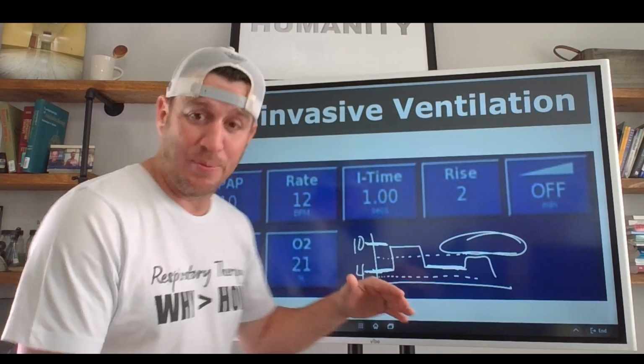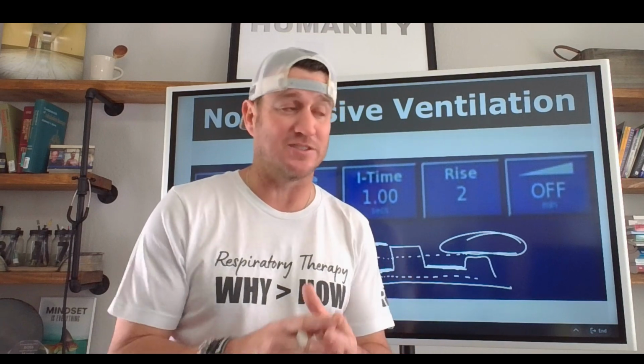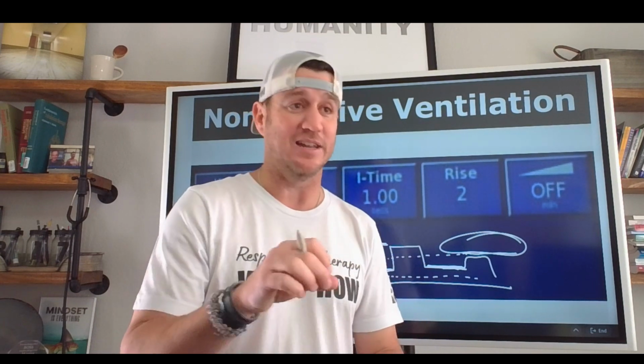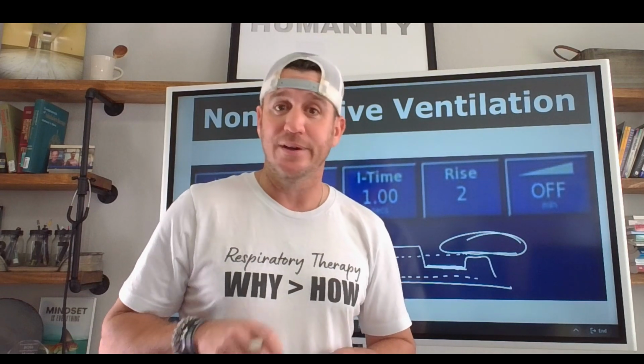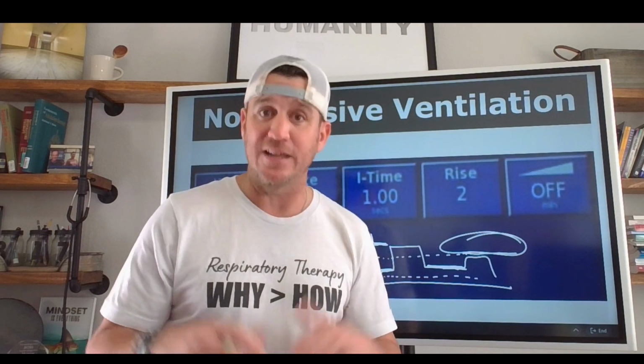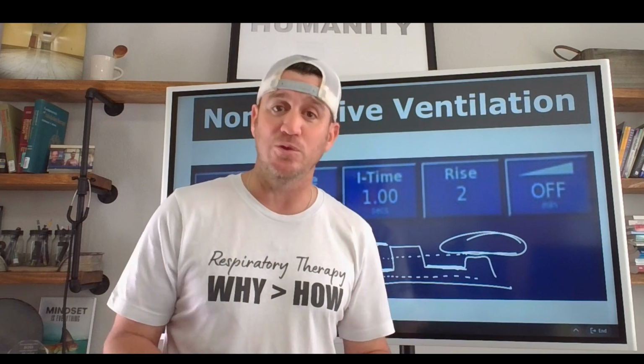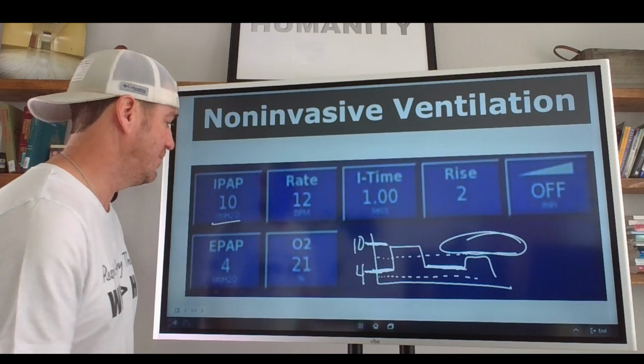It's very, very important. Next time you're in front of one of these ventilators, I challenge you to look at it and tell me. Come back to this video and leave me a comment and say, yep, you're right. It's always set too low. And that's an incorrect usage of that alarm. It's not going to help you.